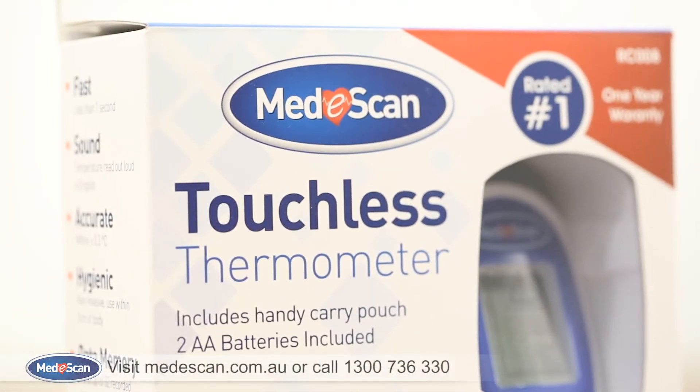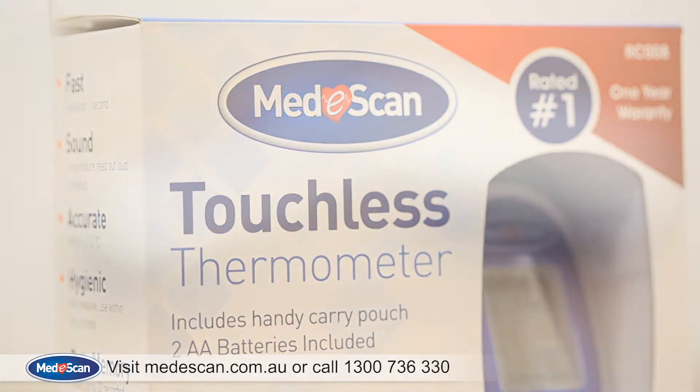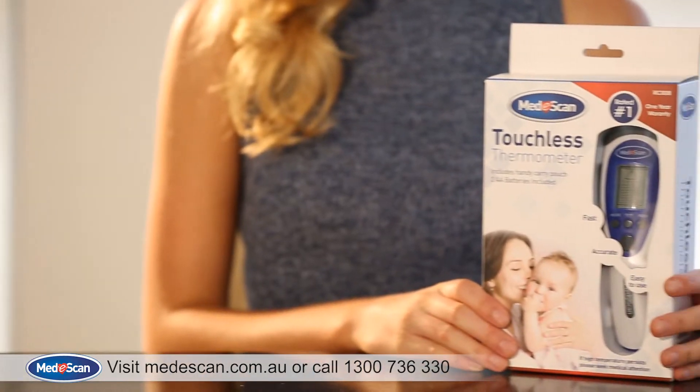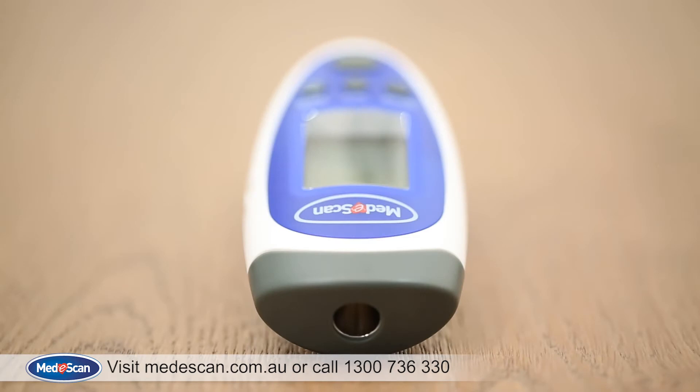Thank you for purchasing the MediScan Touchless Thermometer. This video demonstrates how to use your new MediScan Touchless Thermometer and how to take advantage of all the features it provides. So let's get started.